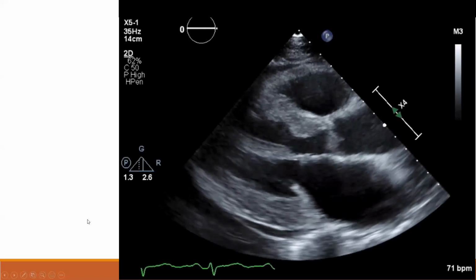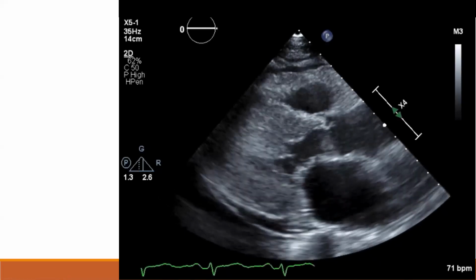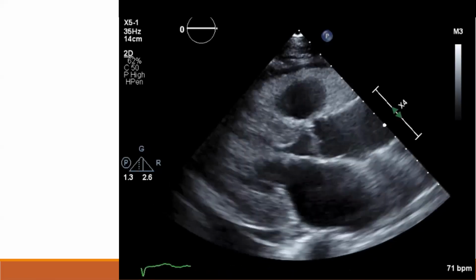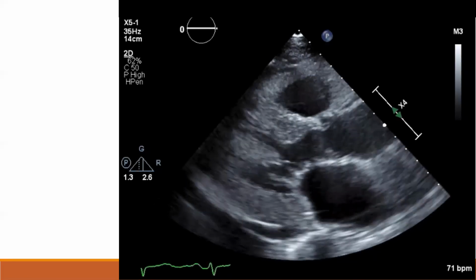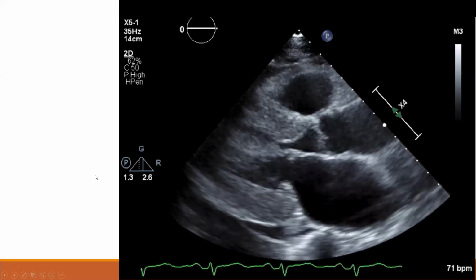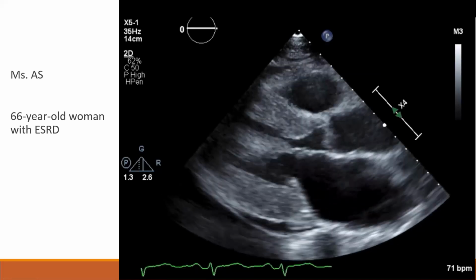So this is another patient. This is another patient that also has concentric LVH, a small pericardial effusion, not too dissimilar from our amyloidosis patient. But this is just a patient with ESRD.